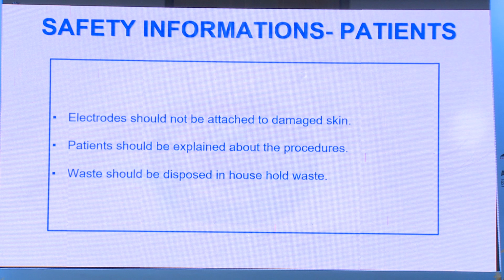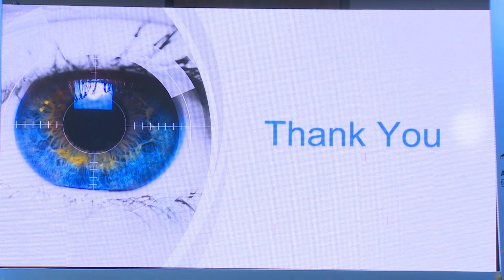For the patients, electrodes should never be used on damaged skin. The patient should be thoroughly explained about the procedure, and all the doubts have to be cleared, and the waste should be disposed of in the household waste. Thank you very much, sir.